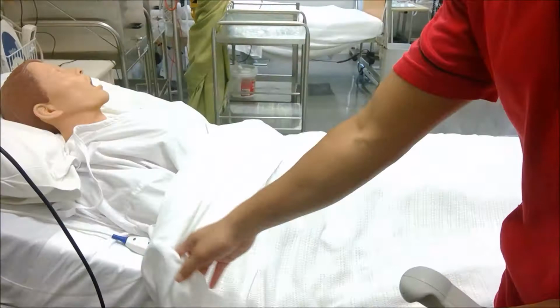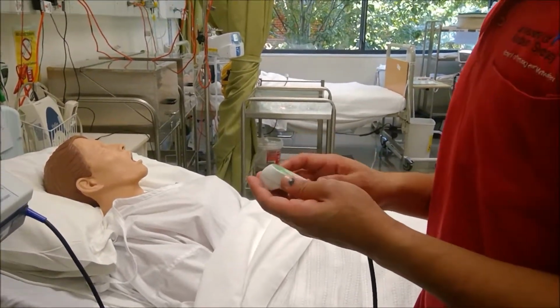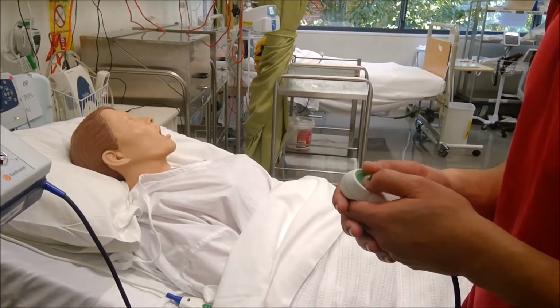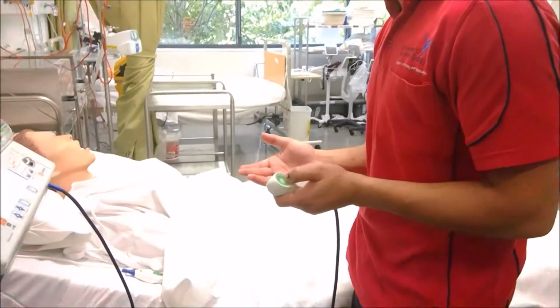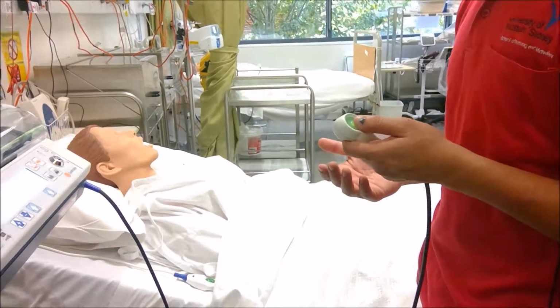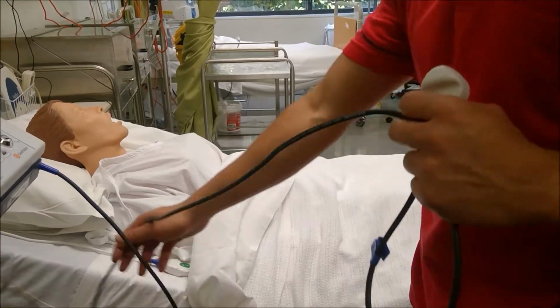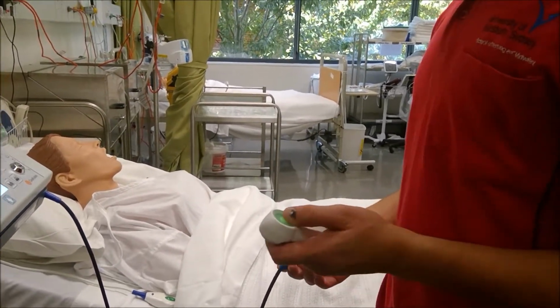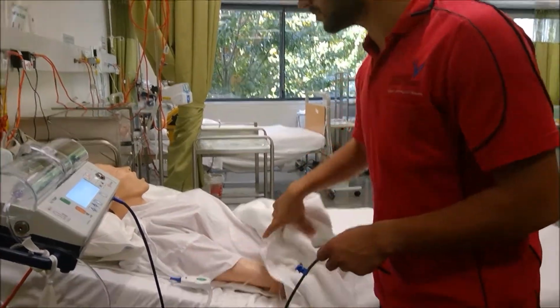Okay, Miriam. I've just connected you to the PCA. It's morphine, which is a pain medication. You press this button once it's green. Once it starts flashing, that means you're being administered the medication. After it stops flashing, you have 5 minutes to wait until you're able to self-administer the medication again. If you try pressing within that 5 minutes, nothing will happen. If you feel nauseous or sick, that's a common side effect. Shallow breathing is also a side effect. If you feel uncomfortable, let me know, and we have other medication to reverse that effect and check up on you. I'll be back within 15 minutes to see if you're okay. In the meantime, if you need me, you can press this buzzer. Thank you for your time today.